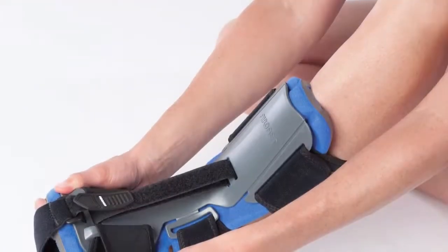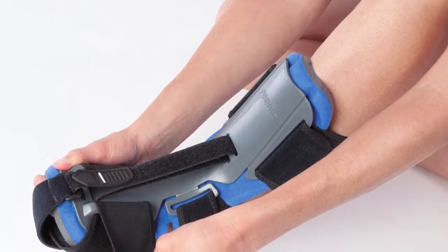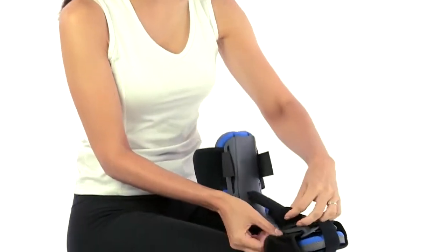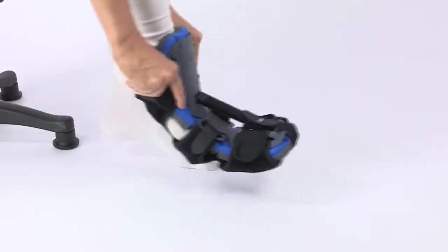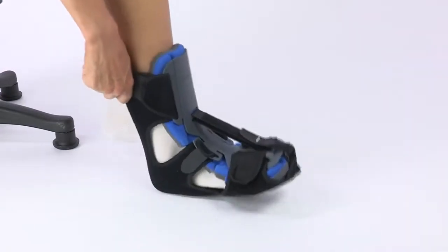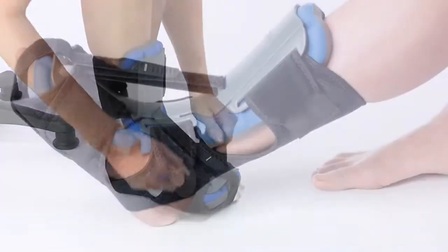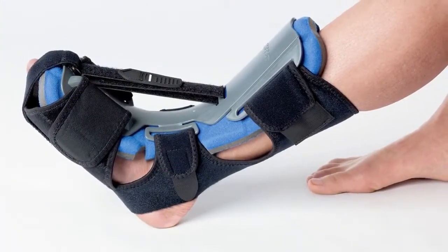Now let's go over how you apply the dorsal night splint. You can use it barefoot or with a sock for added comfort. First, have a seat and make sure that the splint is facing right side up. Ensure that your toes and the ball of your foot are comfortably positioned at the forefoot section of the splint.